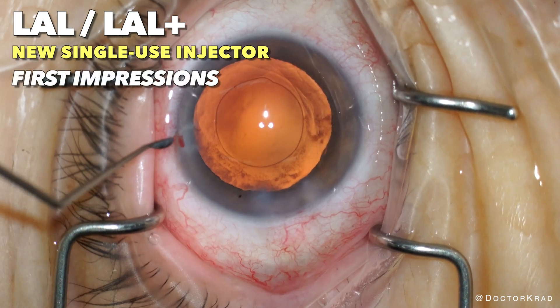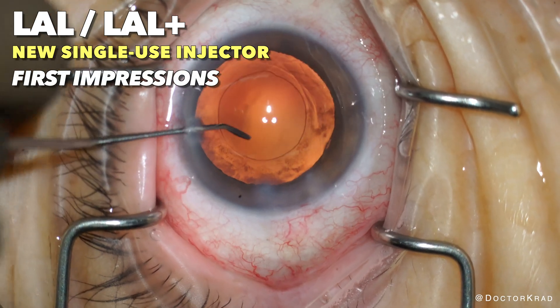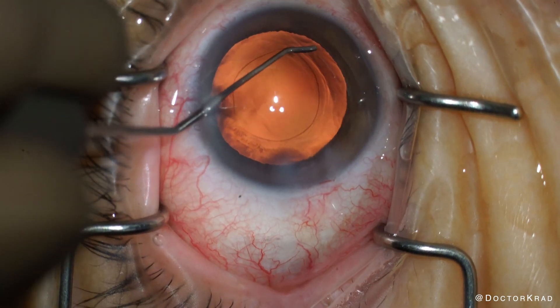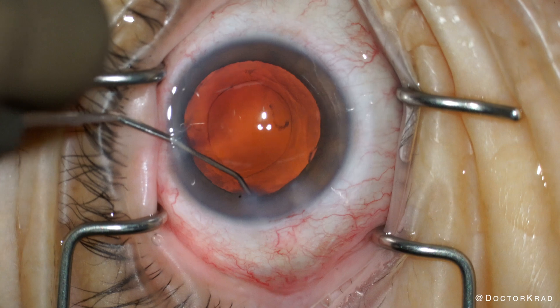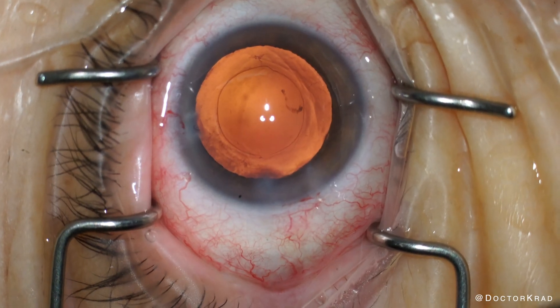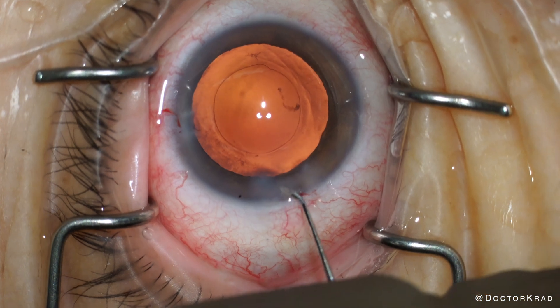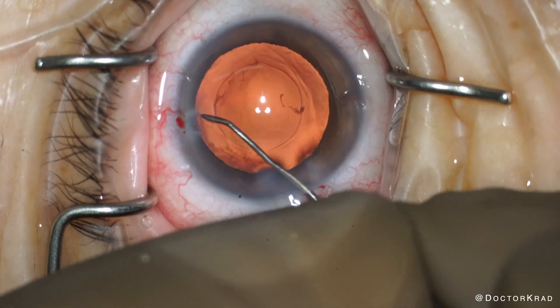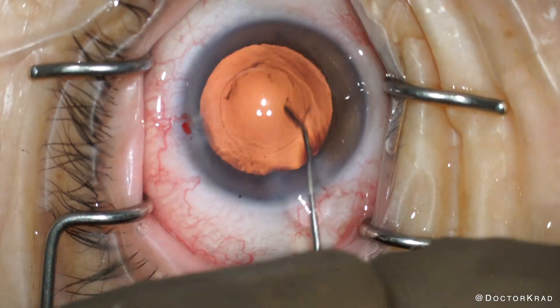Hey guys, it's Dr. Cradd. I just finished removing this cataract, and after a quick polish, I'm about to insert the light adjustable lens. RX-Site came out with a new disposable injector system for the LAL. This is my first experience with it, and I figured I'd share it with you.